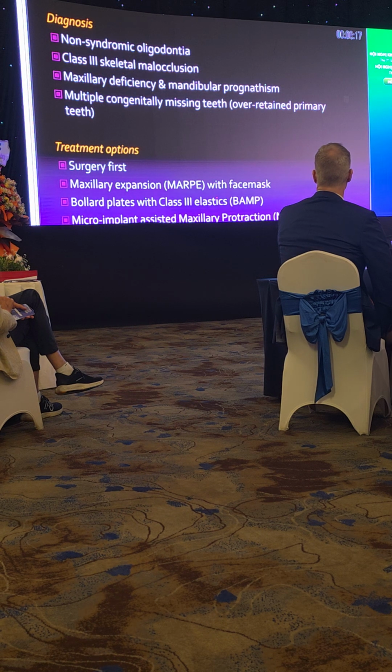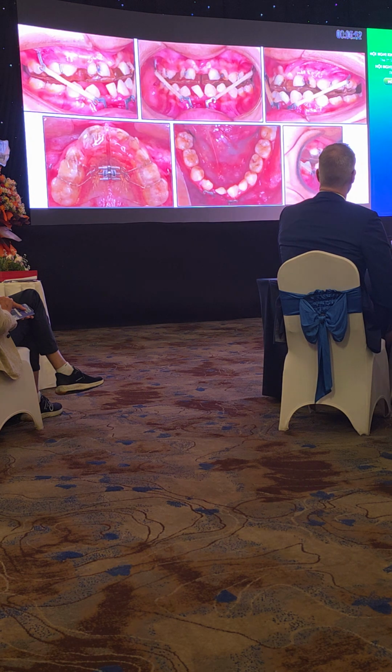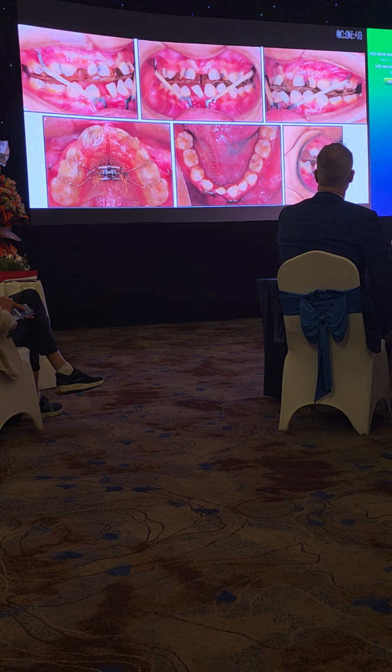Right. Then the final thing is microimplant assisted maxillary protraction, MAPI, with the support of mini-screws. So you can maybe do class 3 elastics full time instead of a face mask. But you have to have a bony plate on the upper. You have to have a bony plate on the lower. Alright? So what are the options that you can do? Well, you can do something like that, with plates on the upper and lower jaws that the patient wears every day. Alright? So basically, this patient has an edentulous area, and you can actually put a few mini screws.